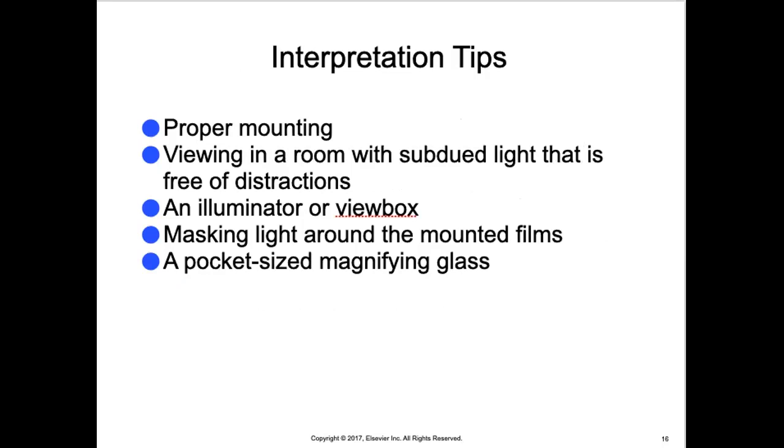With proper mounting, we will be sure that we are not mixing up images from one side of the mouth to the other. You can imagine how bad that can be if we have images that are mounted incorrectly and the doctor uses that and diagnoses the tooth incorrectly. Also, you should be viewing these x-rays in a room with subdued light that is free of distractions. We want the patient and the doctor to be able to focus on the image and not on any distractions in the room.